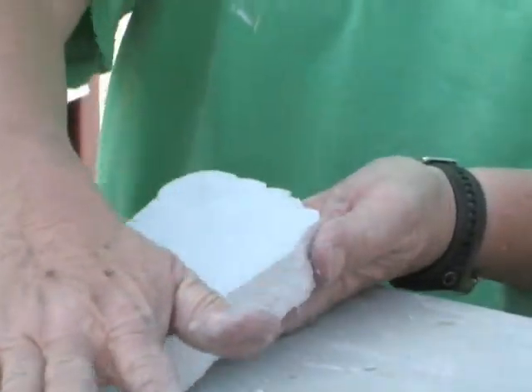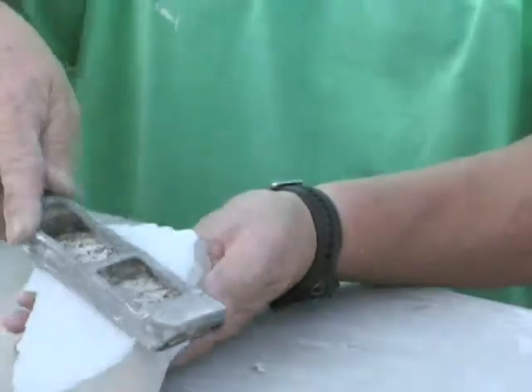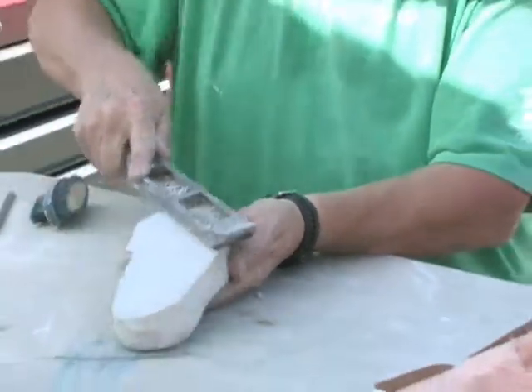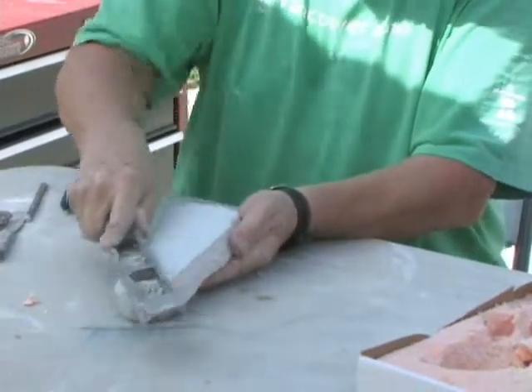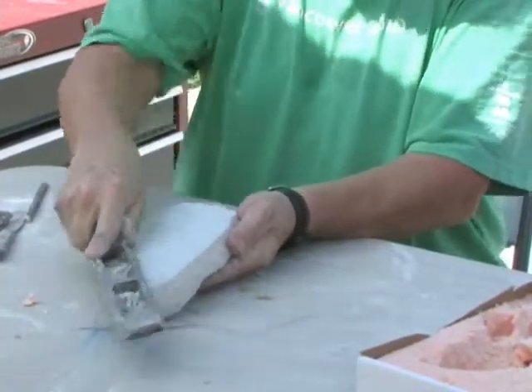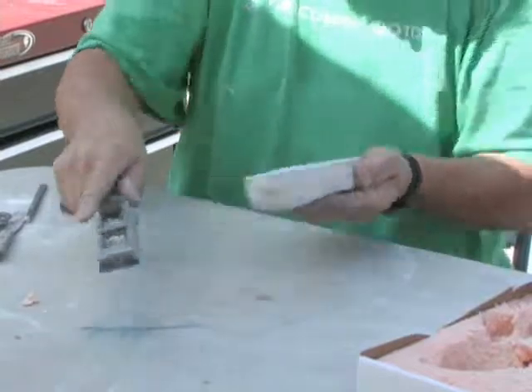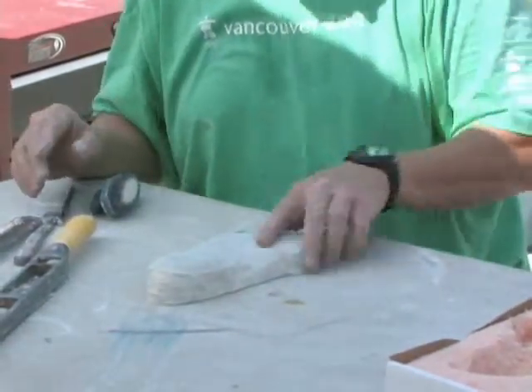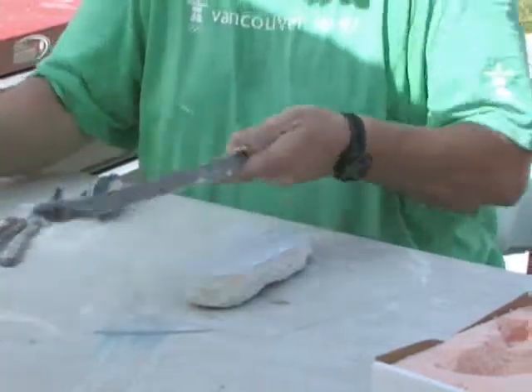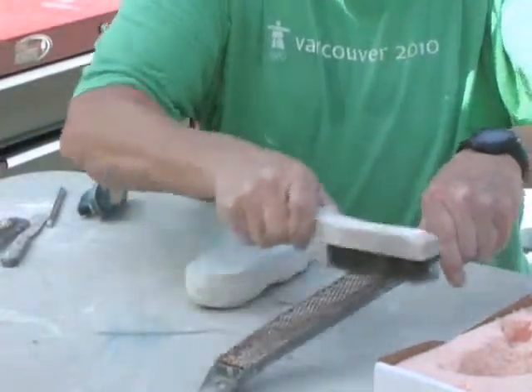I said before I want this to be totally flat, so I take the flat file and go across the cast like so, getting this so that there's no rocking. I put it down on a clean table — no rocking. It's good. I'll clean it with the wire brush.